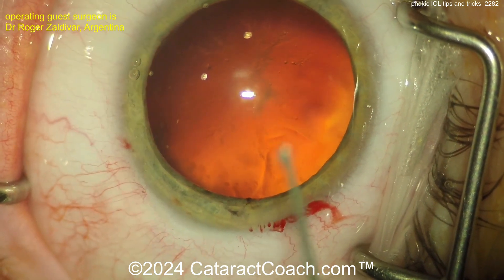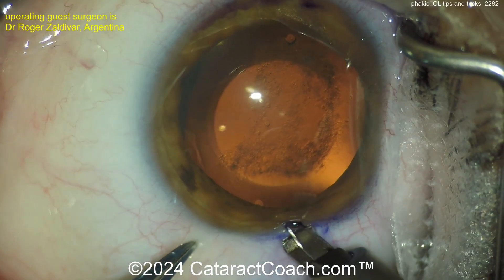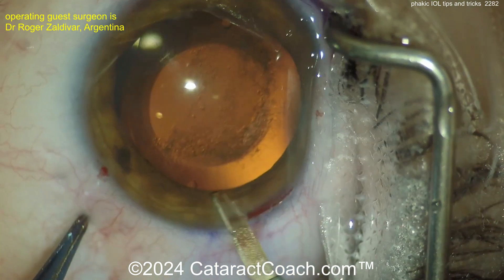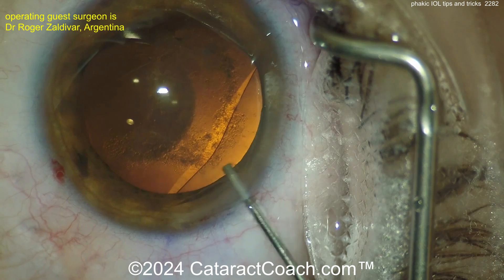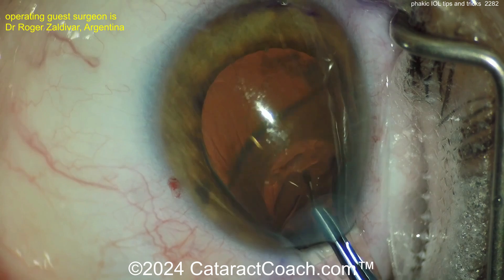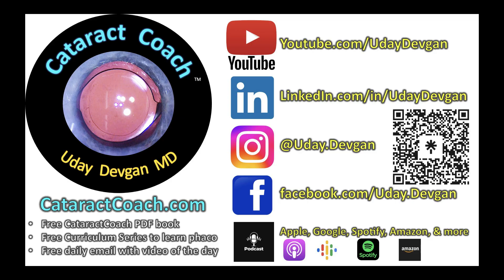Now if you needed to, you could do cataract surgery — this lens is removed quite easily. Let's look at one more: you can see the lens has caused an anterior subcapsular cataract. Making the incision, viscoelastic — put it underneath if you need to. Grab with straight tying forceps and you can just pull it right out of the eye. Beautiful case. Remember, check out that podcast every week — a brand new episode, you'll learn a lot.